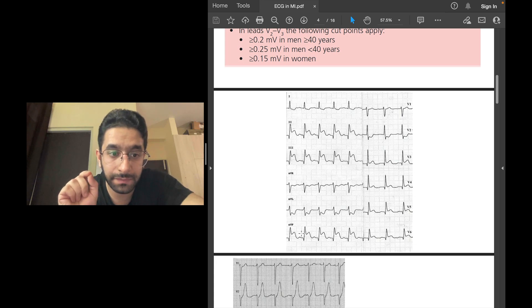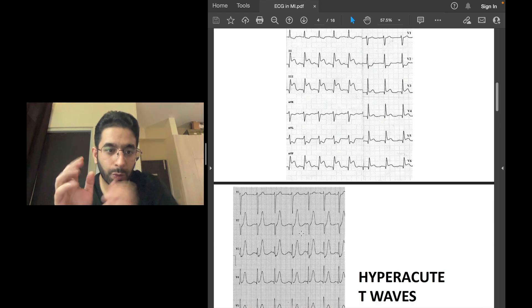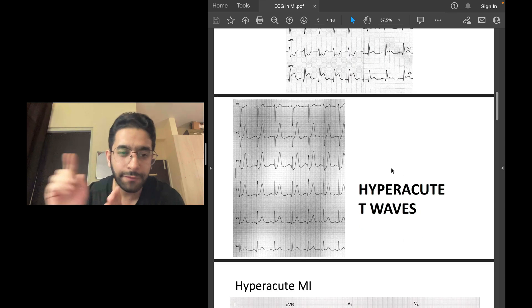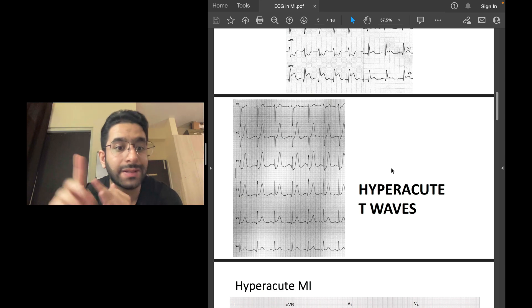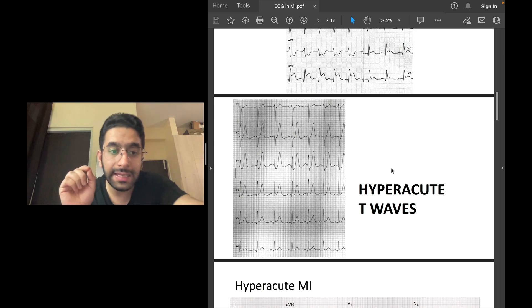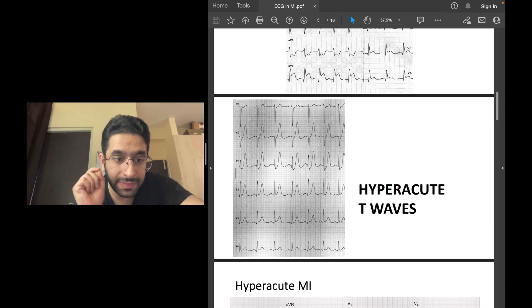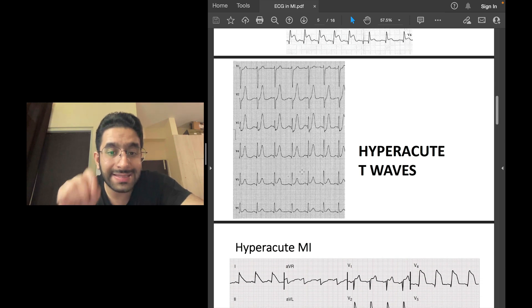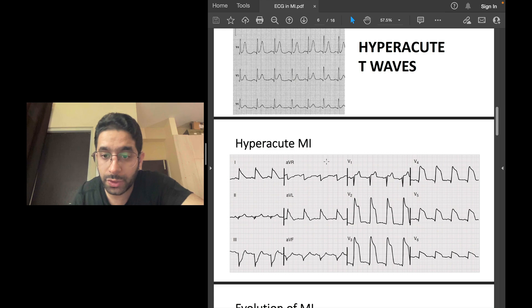Now let's talk about the evolution of ST segment elevation MI over time. The very first change — seen when the patient presents very early or develops fresh chest pain in the ward — is tall and peaked T waves, known as hyperacute T waves. These denote the very acute phase of STEMI. At this point, ST elevation has not yet set in but is soon going to.